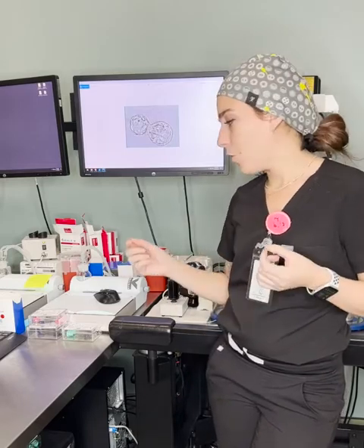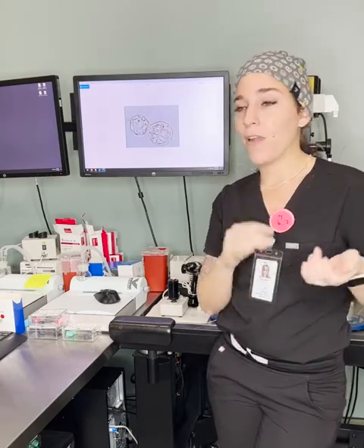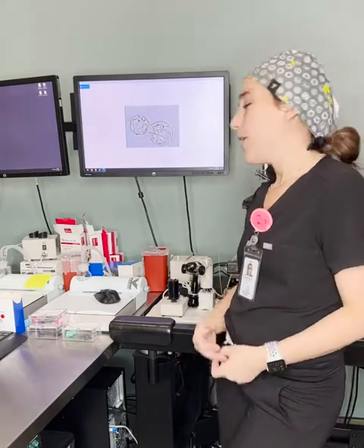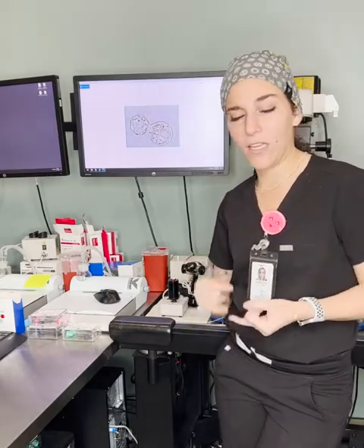So many people get so scared about practices that they used to use back in the day. Acid-based hatching, or something called drilling, where we use something like an injection needle to manually make a hole in the embryo. Those practices were very dangerous and did not have a good survival rate and caused a lot of damage to embryos. Nobody does that anymore. Everybody uses a laser. There's a ton of different kinds of lasers you can buy from a microscope now, FDA approved and totally safe for somebody who's trained and knows what they're doing on the laser. I've never killed an embryo or damaged it using a laser.